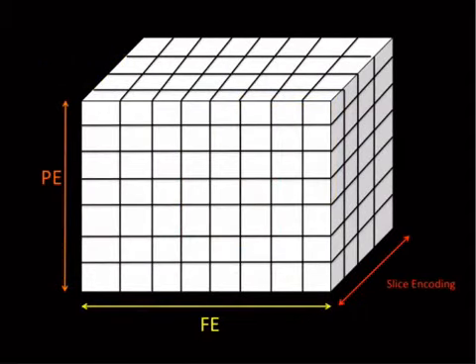Now, that is in contrast to this idea of volume imaging, or 3D, okay? So volume imaging is awesome. It's really, really useful for lots of different stuff. If you are doing rectal cancer staging, it's really nice because you can do basically MPR stuff like you do on CT, and change the planes and get things straight in axis. I think it's pretty useful with brain MR too.